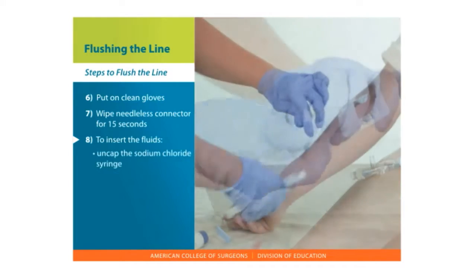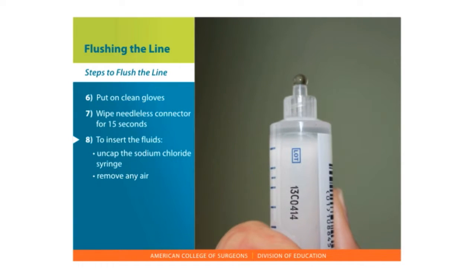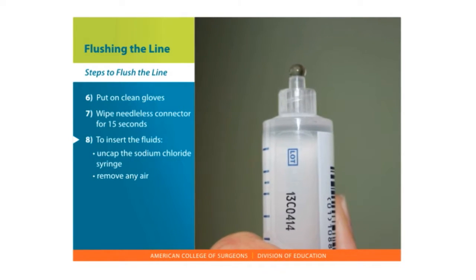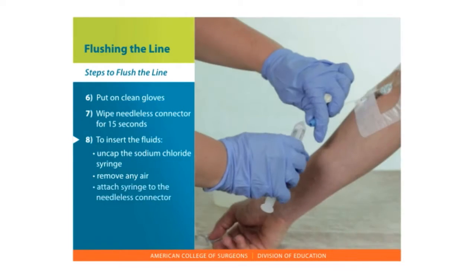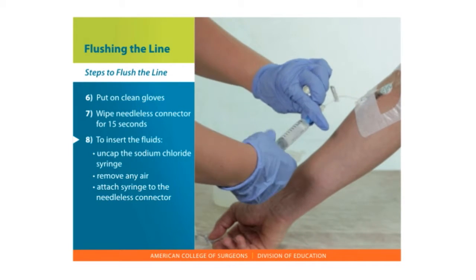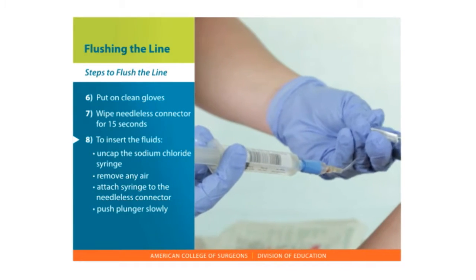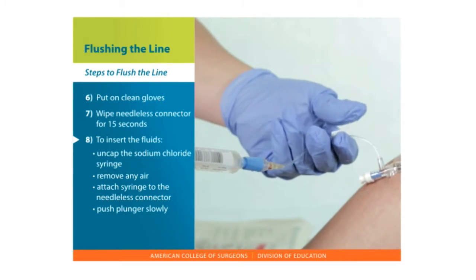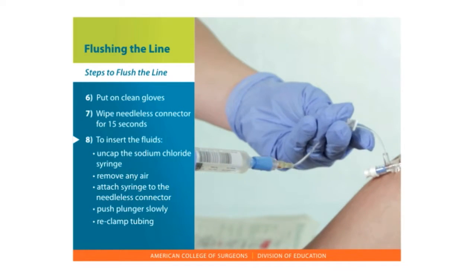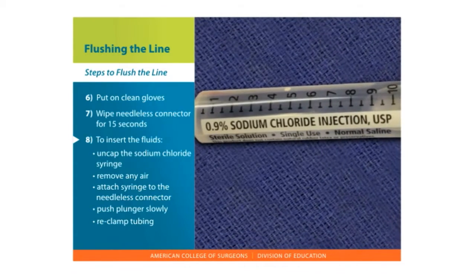To insert the fluids, uncap the sodium chloride syringe. Remove any air by holding it upright and push the air out from the tip. Attach the syringe into the needleless connector. If there is a clamp, unclamp the tubing. Push the plunger slowly so the fluid goes into the tubing. Re-clamp the tubing if a clamp is present. Follow the same directions if you will also be inserting heparin.